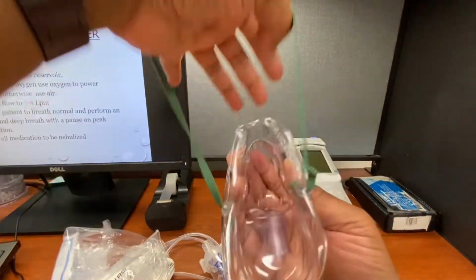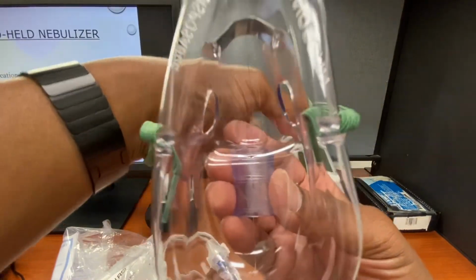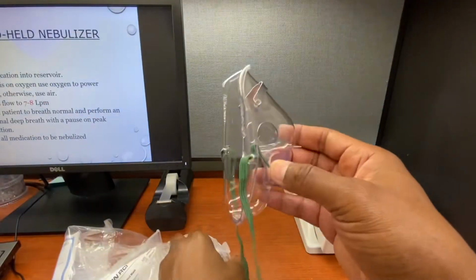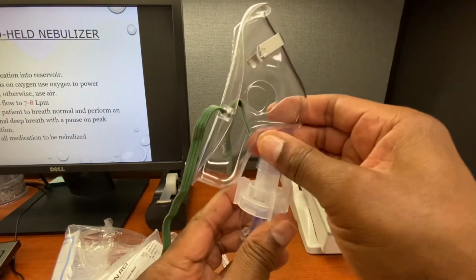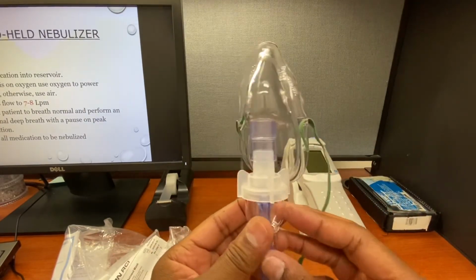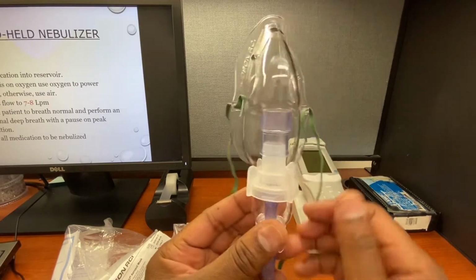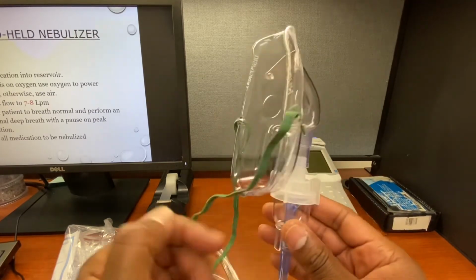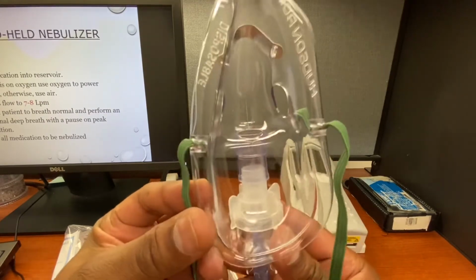This is where it goes over the head and it goes right on the face, okay? So all you have to do is put this right on here. And that's how it looks. So if this is somebody who can't control the mouthpiece, they can't hold the mouthpiece up, they have issues with consciousness or something like that, they can't coordinate, the aerosol mask is great.